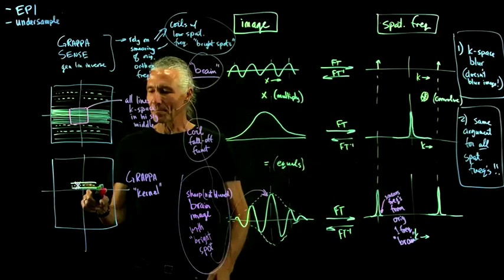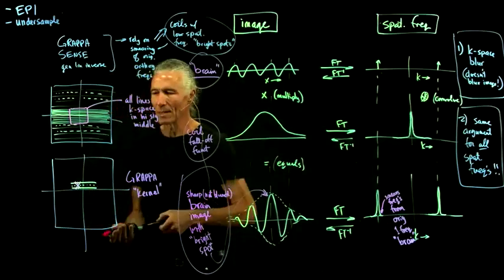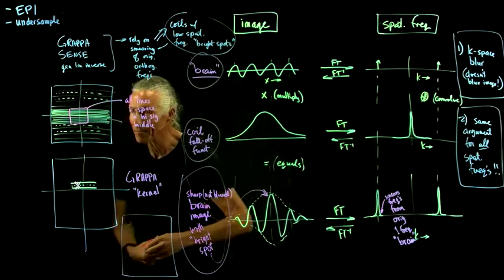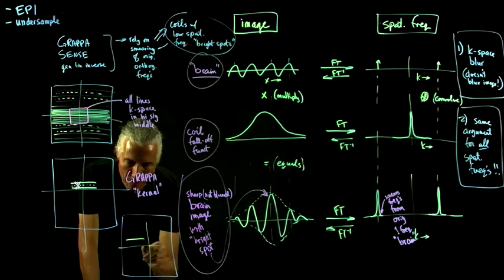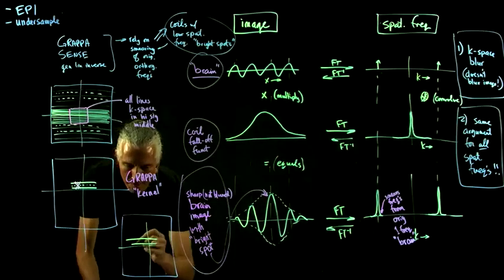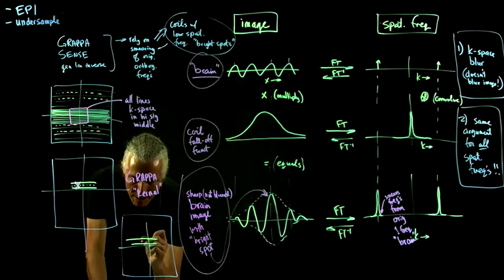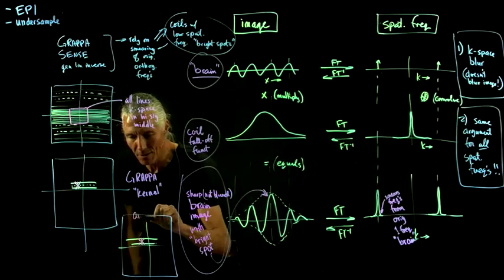And in fact, you have even more data than just this one slice, because we've got another slice over here, from a different coil, and with that different coil slice, we can do the same thing over there. And so we can take that same point and try to predict what that point should be from the other slices too. So this is another coil K-space.